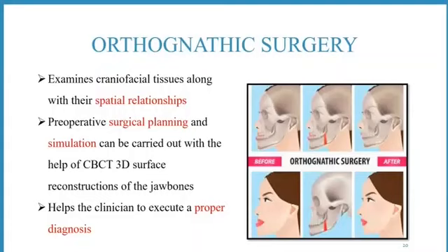Treatment options can be recreated or checked with the help of virtual models of anatomical structures fabricated from the CT volumes and registered in three-dimensional image data, which are capable of creating anatomically correct substitute grafts. It helps the clinician to execute a proper diagnosis.